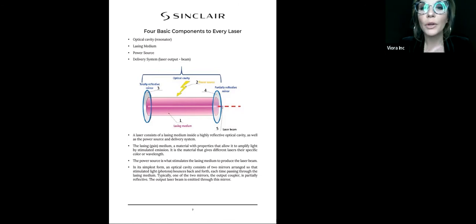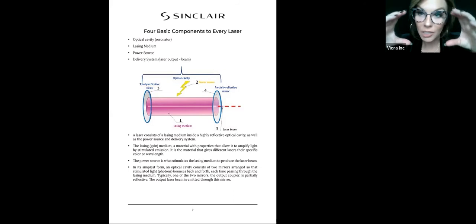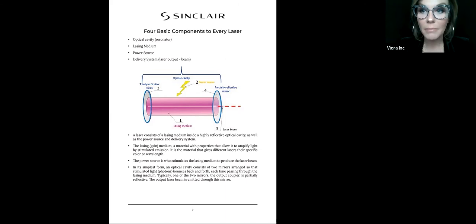Okay, so we first have an optical cavity. It's just the cavity that's housing everything. Then we have a lasing medium, and the medium can be a solid, it can be a liquid, it could be a gas, it could be a dye. So CO2 is a gas, ruby is a solid.